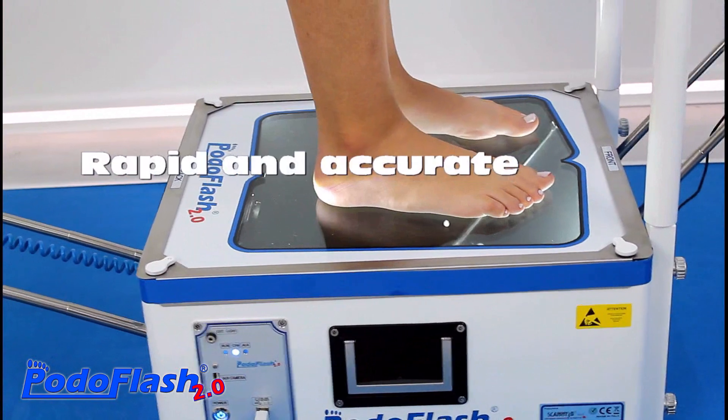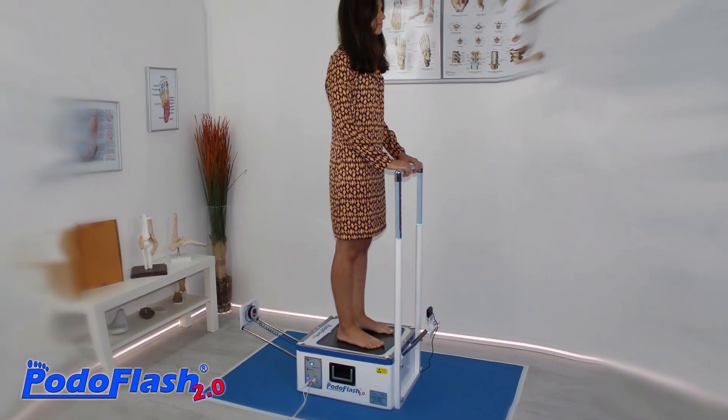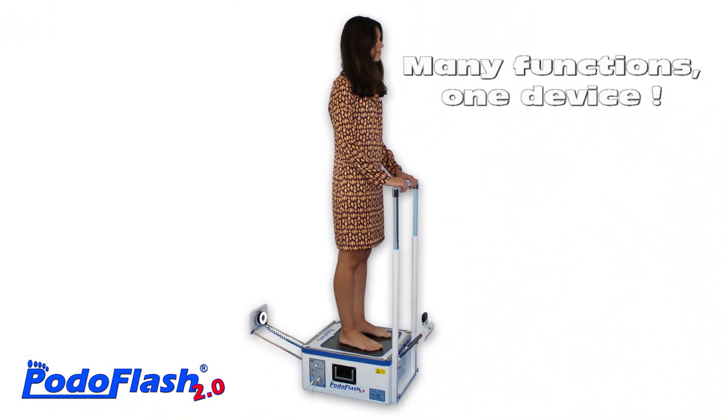In a few seconds, this podoscope allows an accurate foot scanning for the evaluation of its morphology, footprint and plantar loads.